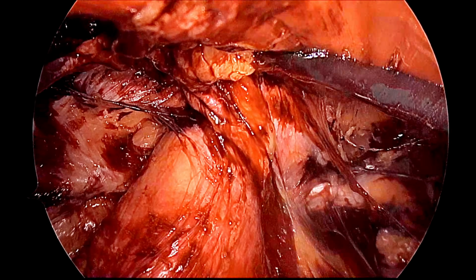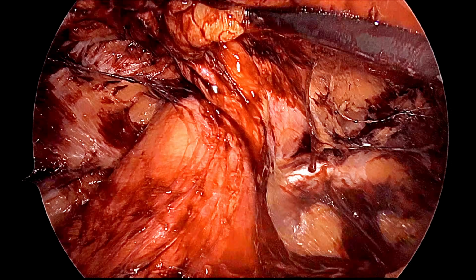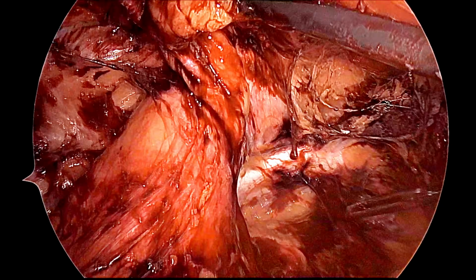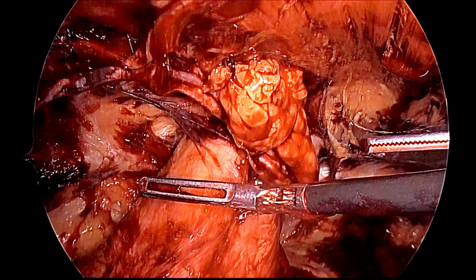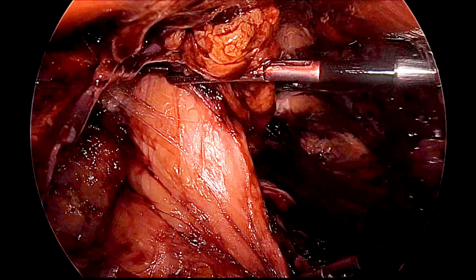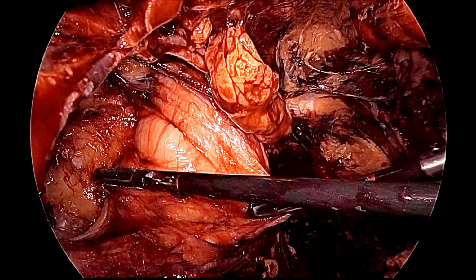Here you can see this is the Cooper ligament, which is also called the lighthouse, and this is the space of Retzius, that is the retropubic space, which is also visible. Below is the bladder. So, you have to be careful that the bladder should not be injured, and now we will do the sac dissection. During sac dissection, slowly you should push the transversalis fascia above and you should pull the sac down.